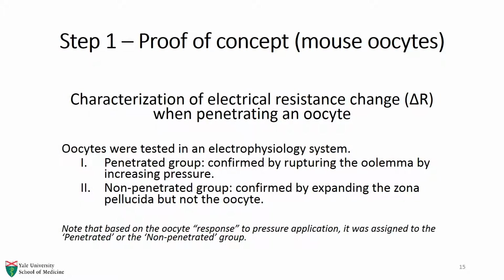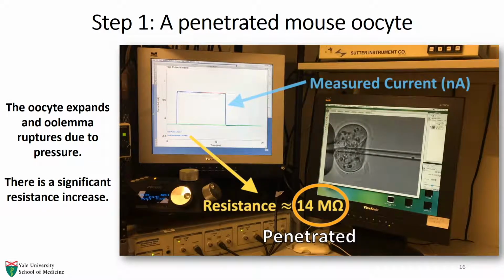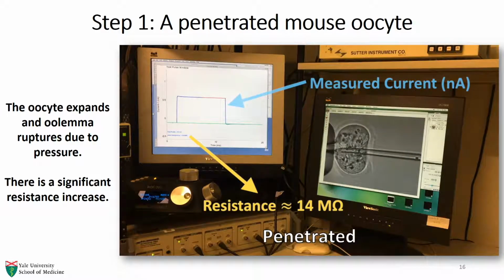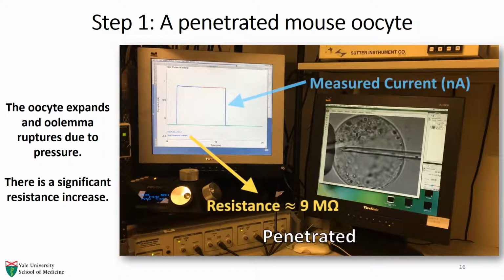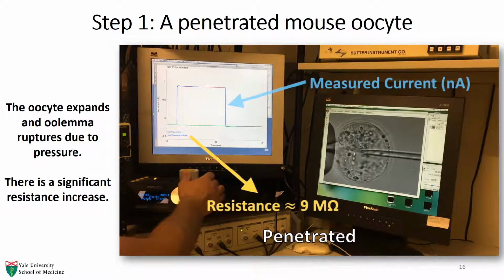As proof of concept, we characterized the electrical resistance when piercing versus not piercing the oolemma. In order to do so, we applied positive pressure through the ICSI pipette. Penetrating the oocyte leads to a resistance increase, and rupturing the oolemma with high pressure results in an immediate resistance drop to baseline.